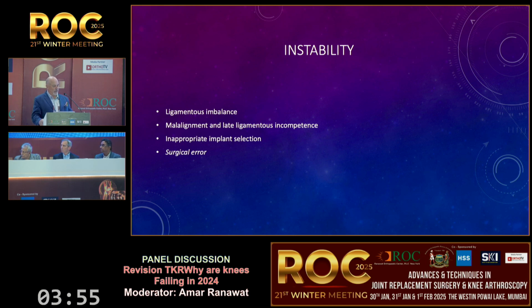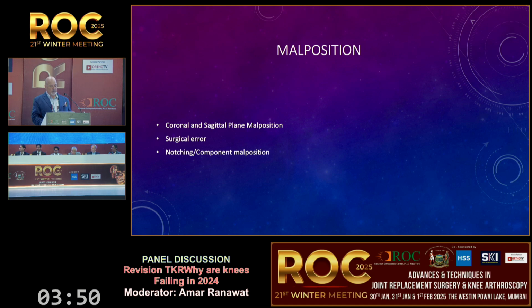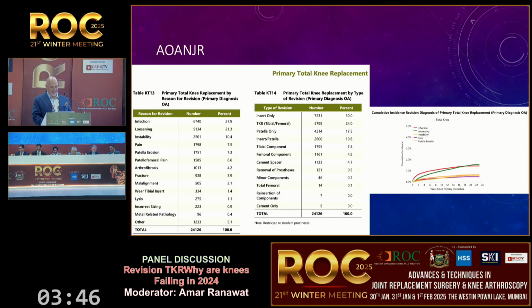So we have infection, patient problem, probably, most likely. Loosening, early loosening at least, surgical problem. Instability, surgical problem. Malposition of components, surgeon's problem. A non-robotic surgeon's problem. So let's go to pain, that's number 5 on the list.